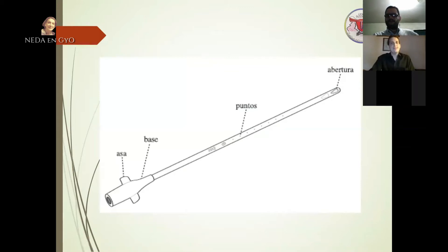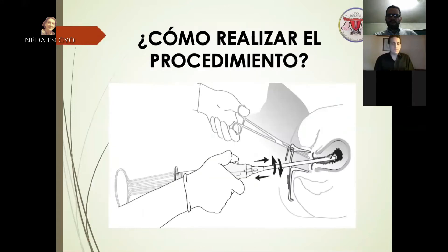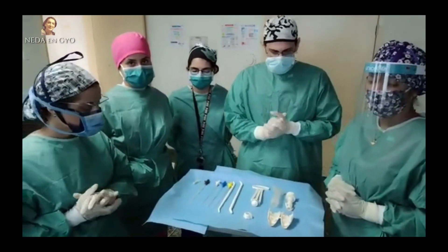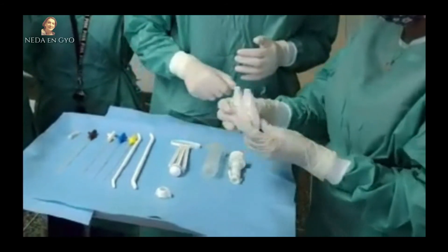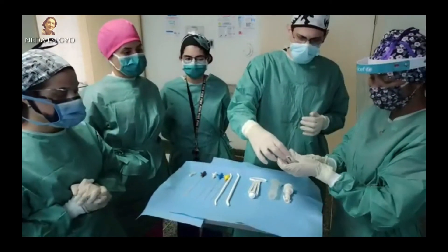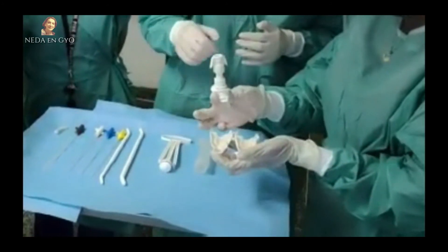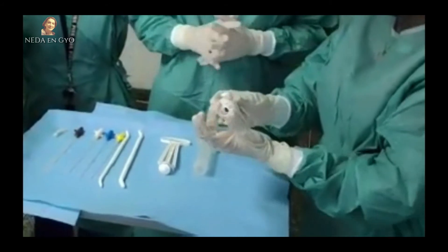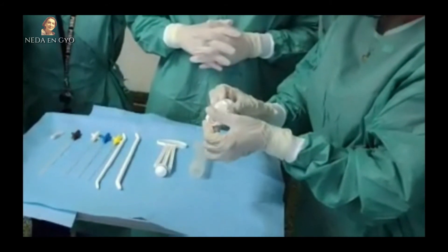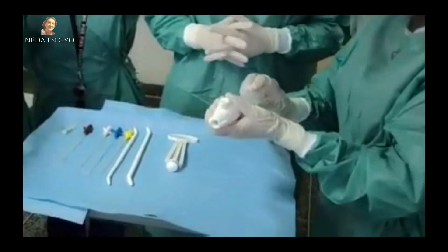Para armar el sistema Easy Grip o sistema de fácil agarre: se toma la válvula, se coloca el revestimiento dentro de la misma, se cierra la válvula y se coloca la tapa. Una vez colocada la tapa, se conecta el cilindro.